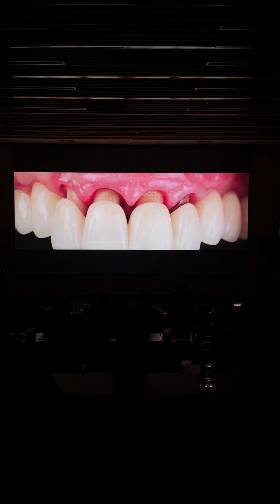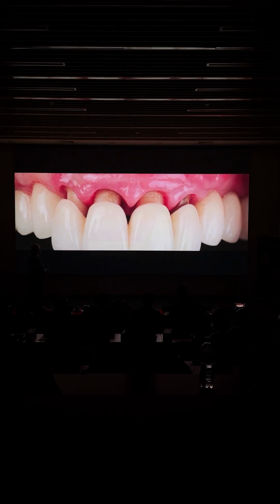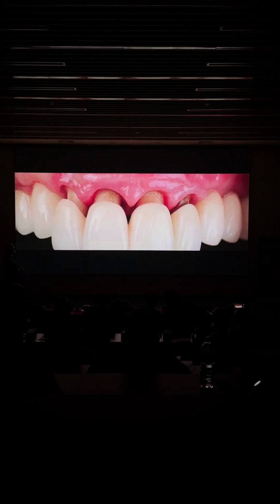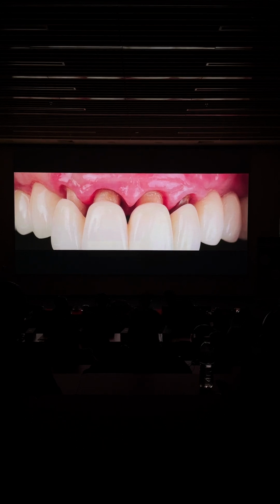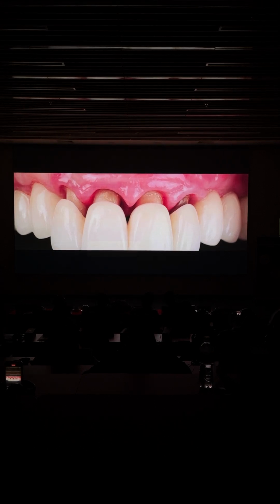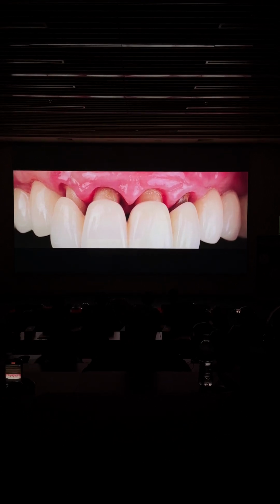So every time I do orthodontics in all patients like this one, I always splint my teeth. For me, there is nothing more frustrating on adult patients than not splinting the teeth and then having movements of the teeth, open contact points, intrusions or extrusions of the teeth. So in adult patients, I always splint the teeth in different ways, as you will be seeing also later on after the break.